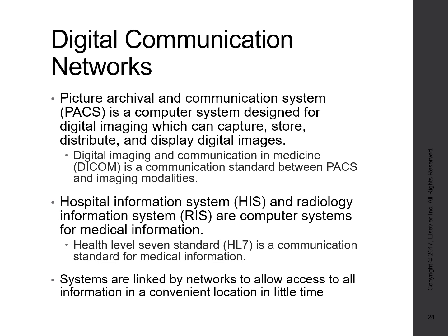These systems are fantastic because anybody that is a member or given access to a PACS system can go in, retrieve that image, look at it, close it up, and it's still going to exist in the system. So multiple people can be evaluating an image at the same time, which may not seem that significant, but as before, if you took an X-ray image on film and somebody checked that image out and took it to surgery and never returned it, that image was gone forever.